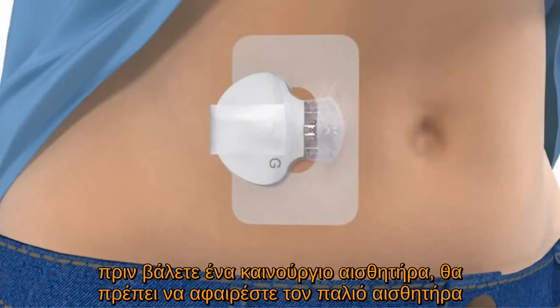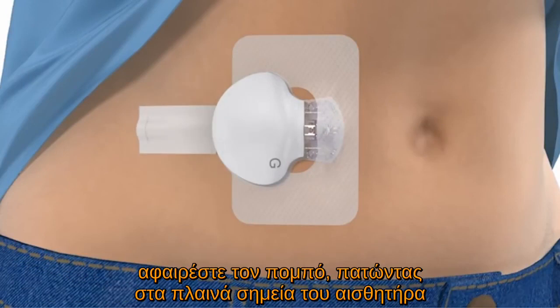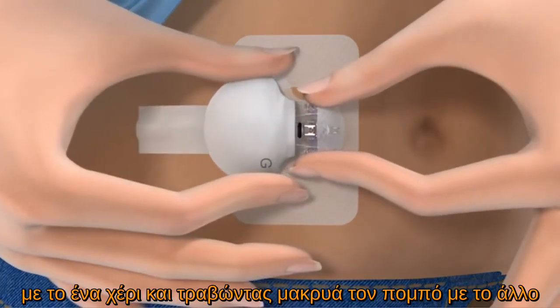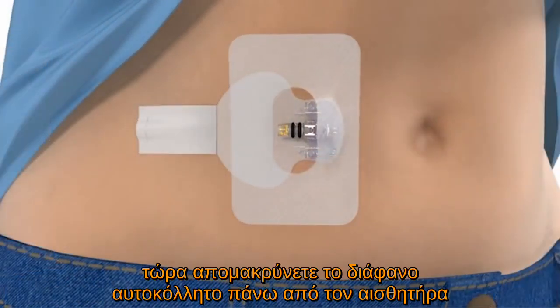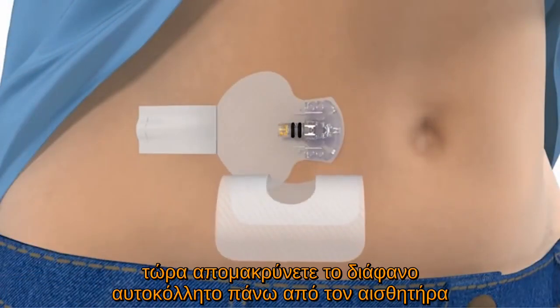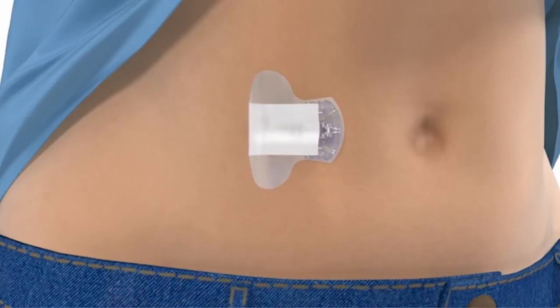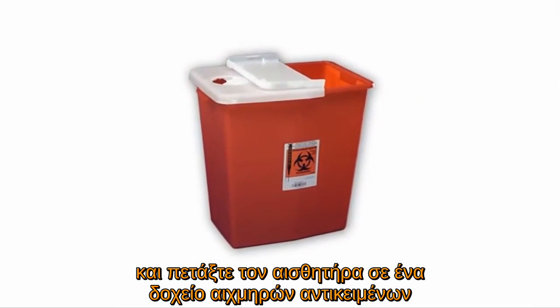Before you insert a new sensor, you will need to remove your old sensor. Peel the adhesive tab off the transmitter. Disconnect the transmitter by pinching the flexible arms of the sensor with one hand and pulling the transmitter away with the other. Now peel off the transparent sensor overtape. Next, loosen the sensor adhesive by lifting up the adhesive tab. Remove the sensor from your body and discard the sensor in a sharps container.